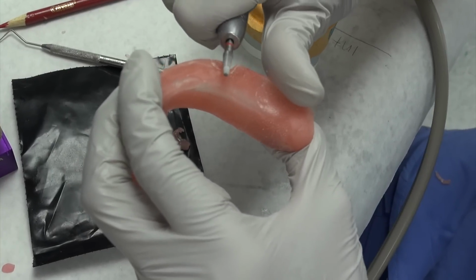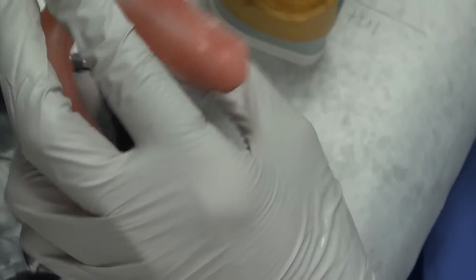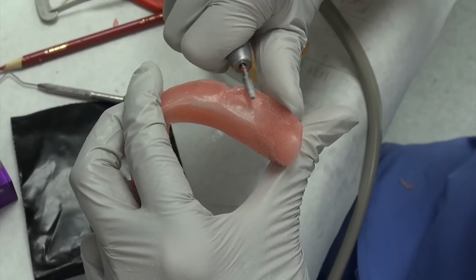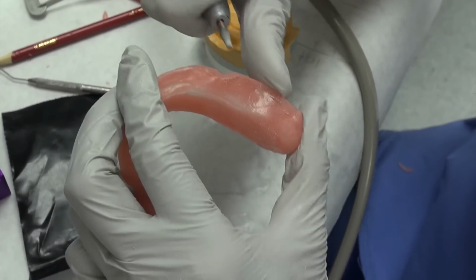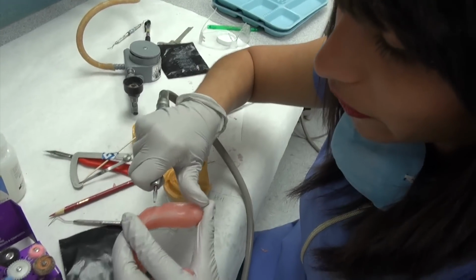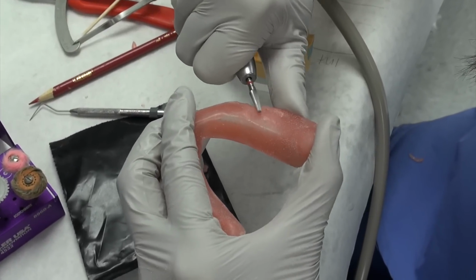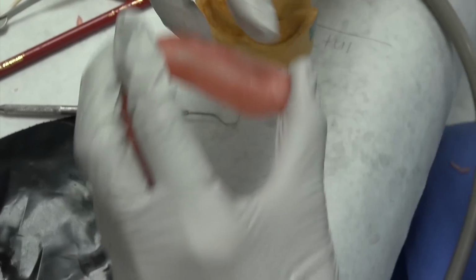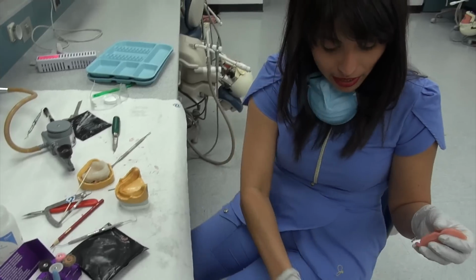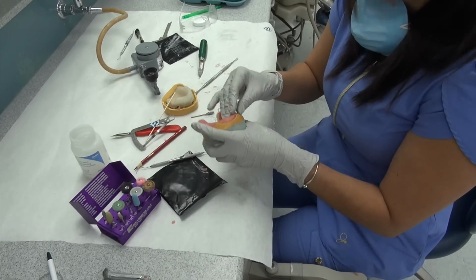Okay, and then just thin it out. You're just trying to get rid of that excess, and that really happens when it kind of puckers right there, okay? So you're really not thinning it too much. Just think of it as you're just removing the part that's kind of puckering up, okay? Now, for time purposes, I did it really quickly, but if you have the time and can spend a little bit more time there before you cure it, then you can get rid of that pucker prior to curing.